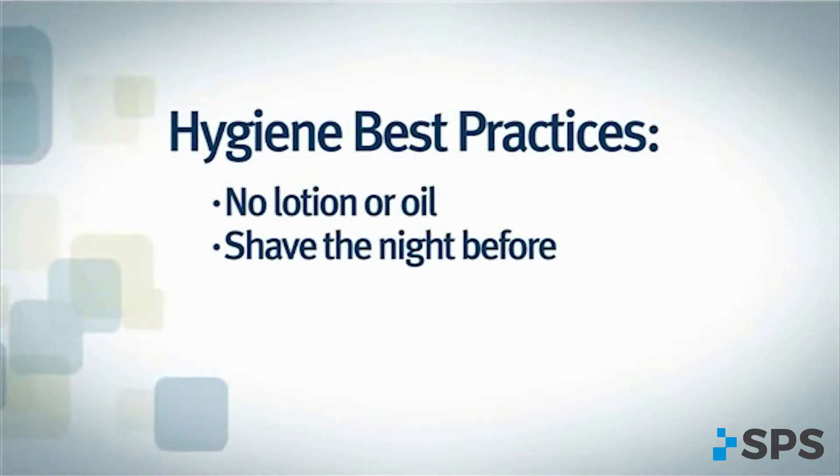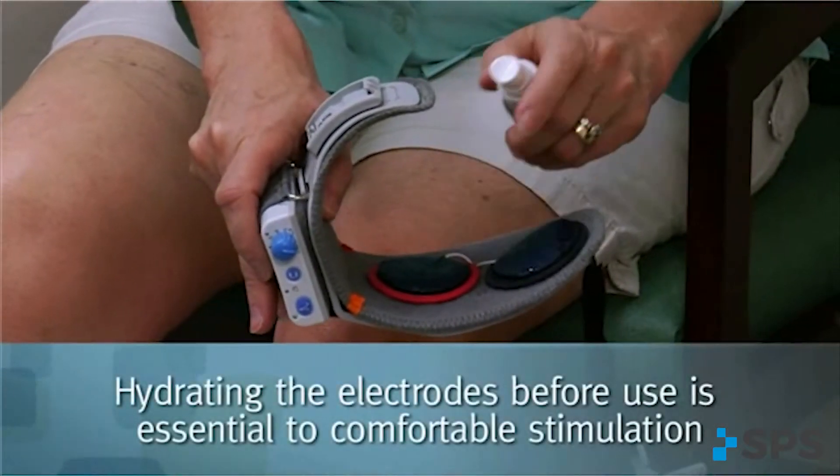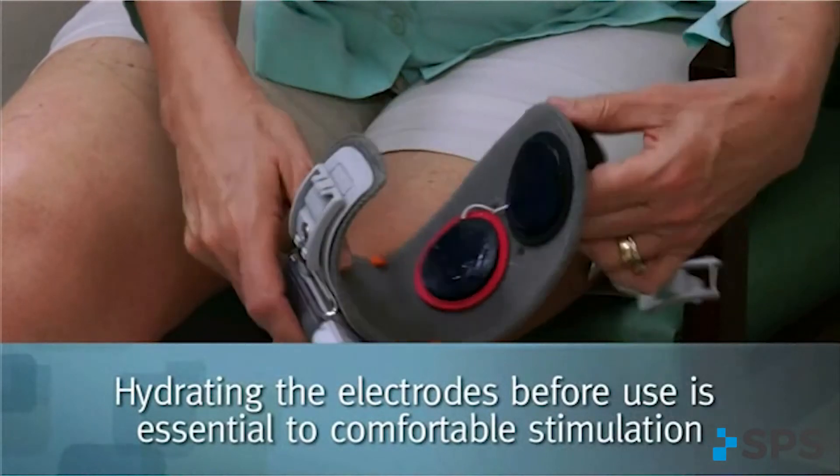Natural soaps, light lotions that are removed with water prior to electrode placement, and shaving at night are recommended. Wetting the electrodes before use is essential to a comfortable stimulation.